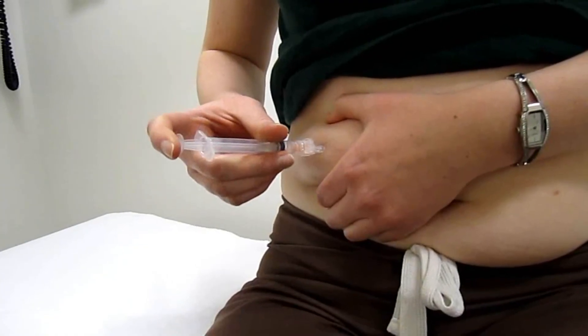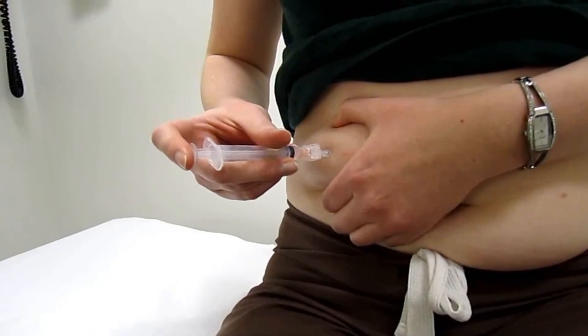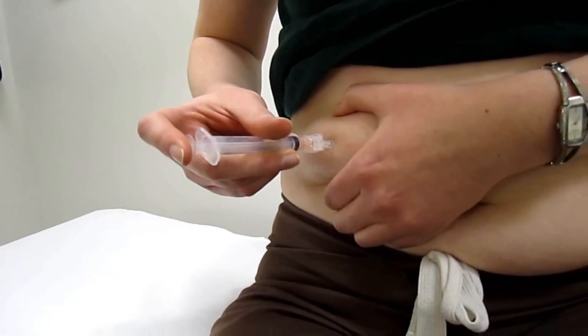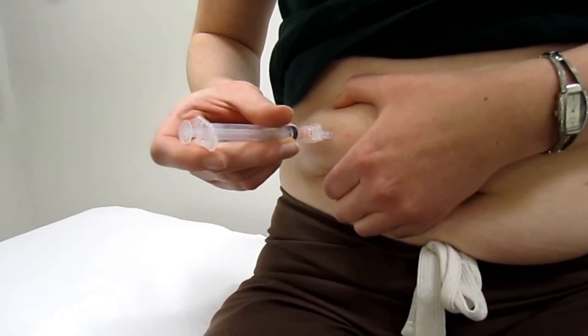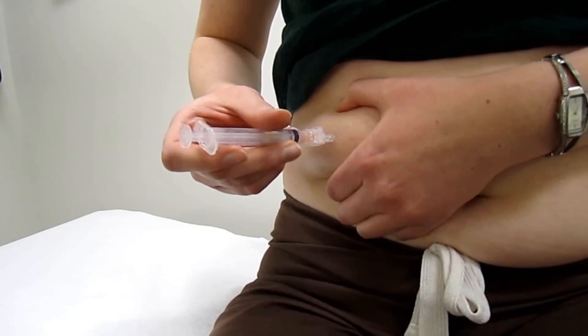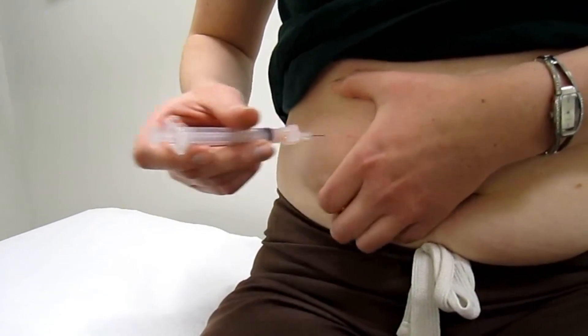We're going to use our index finger to inject our methotrexate into the abdomen at a rate of 3 to 5 seconds. We're going to hold the needle after the plunger is all the way down for 1 to 2 seconds to allow for some absorption, and as we let go of our skin, we'll pull the needle out.